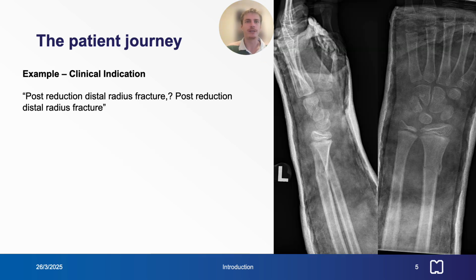During the reduction process, the doctor gently realigns the broken bone fragments using traction and manipulation, in some cases checking the alignment with fluoroscopic imaging, and in more complicated cases, open reduction or surgery is needed. After alignment, a molded cast is applied to immobilize the limb, ensuring the fracture heals correctly. Imaging is then used to check that the reduction was done properly.